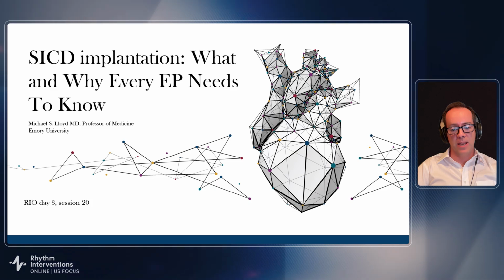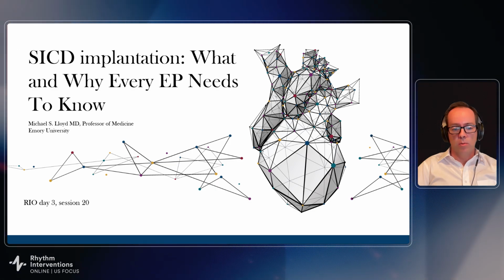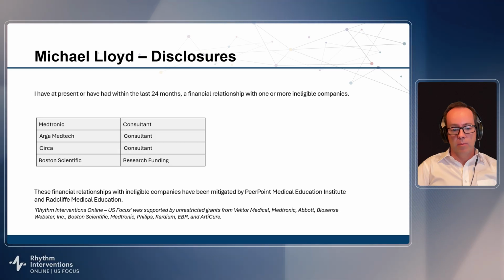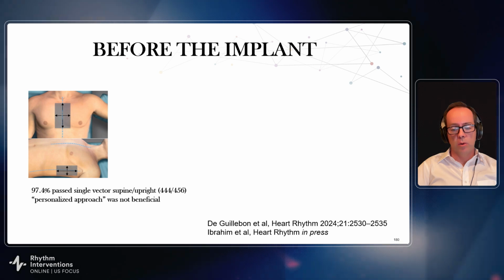I'm happy to be here and wrap this up. I was watching yesterday and saw a lot of great content. Hopefully this is going to be review and highlight some things that were talked about in some of the earlier sessions. I think when it comes to the SICD implant, before the patient gets on the table, we need to spend a second on screening.